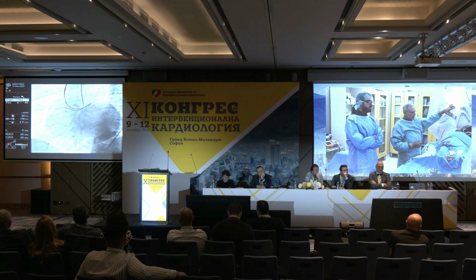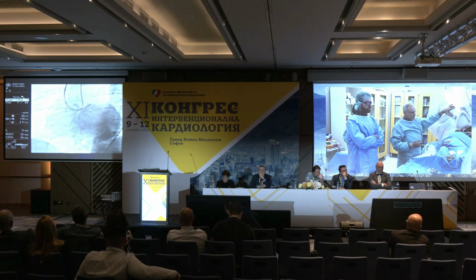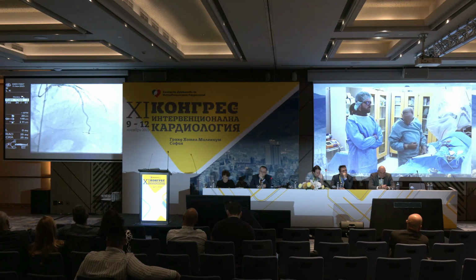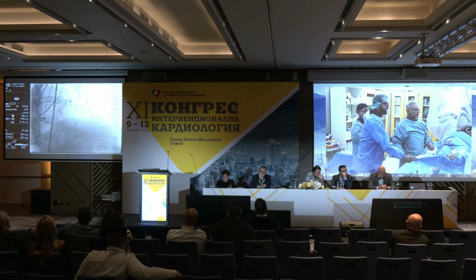When we do retrograde injection, we can see that it is definitely going in completely the wrong direction. Based on that, I didn't insist more, as I thought that the occlusion is not very long. We have good collateral circulation. That's why essentially we shifted now to the retrograde approach without losing much time.